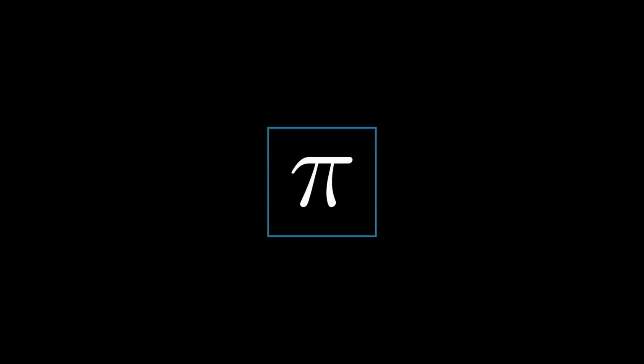For simplicity, let's only choose a 2D slice for discussion. And, as this rose has quite a complex structure, let's choose an image of the mathematical symbol pi, which consists of only 3 lines. This is just a 2-dimensional object with the shape of a pi that we use as a test object in the so-called object space. Note that every object space related thing in this video is annotated with the color blue.